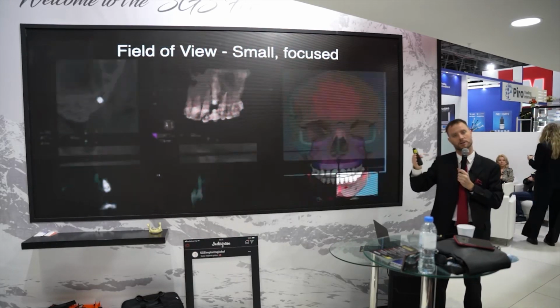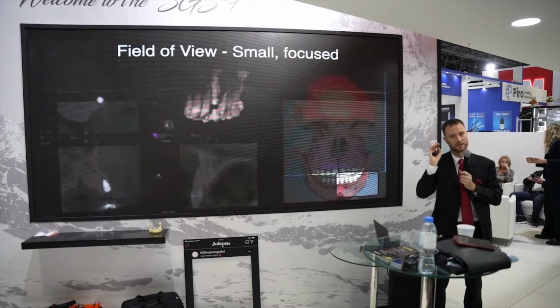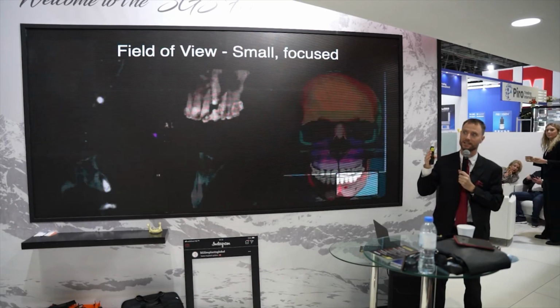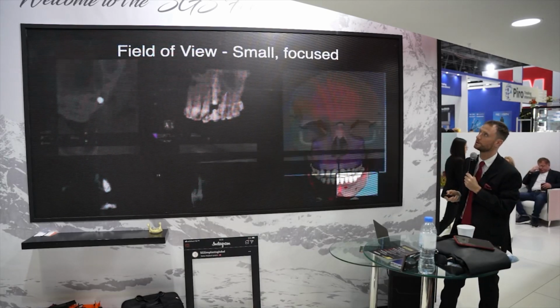If you do a right lower implant, but on the CT you have the full arch of the patient, and in the left upper side there is a tumor that you don't realize, and 3 years later patient gets into the hospital, they ask for the CT and it was visible there, it's your mistake, you did a failure. So it's important to focus on what you're doing.